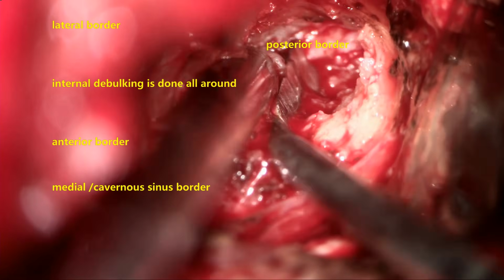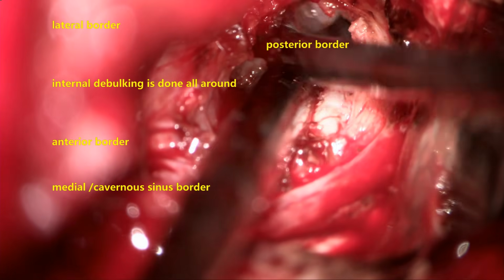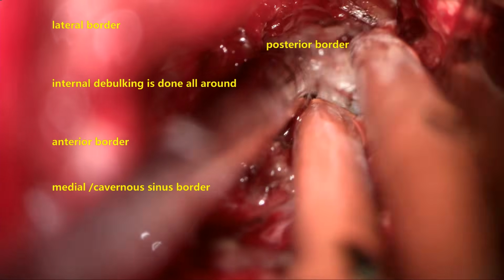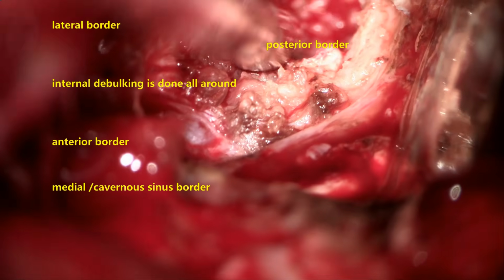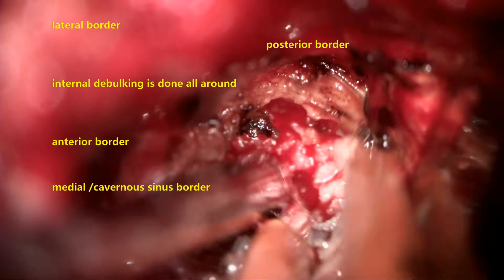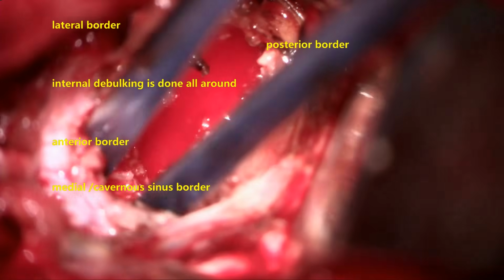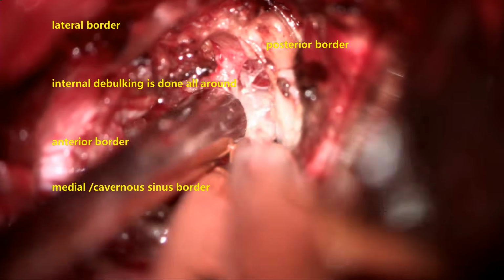Now the internal debulking is done all around gently. These movements of internal debulking need to be very gentle, because of the branches of the trigeminal nerve, that is first, second, third, the ophthalmic, maxillary and mandibular divisions. Many times in these tumors, the tumor originates from a few fascicles of the nerve, and many times we can preserve the nerve divisions while dissecting the tumor and preserve the divisions quite significantly.